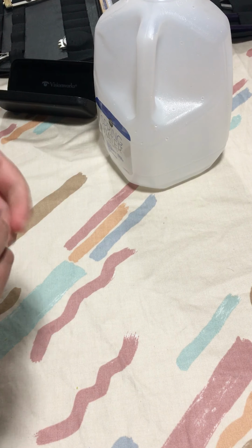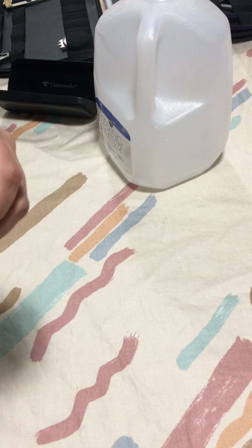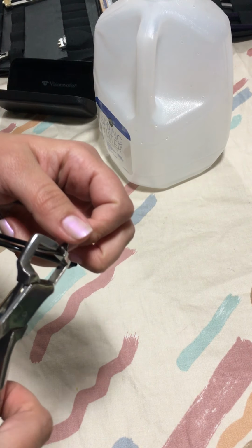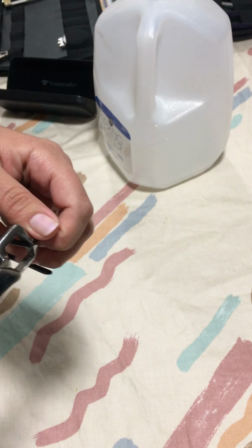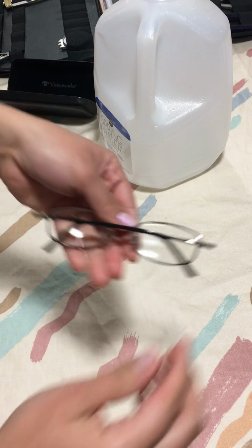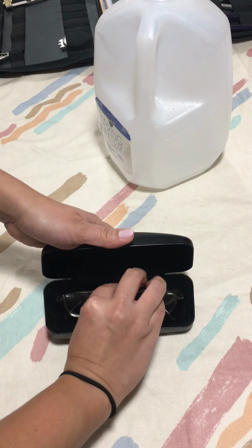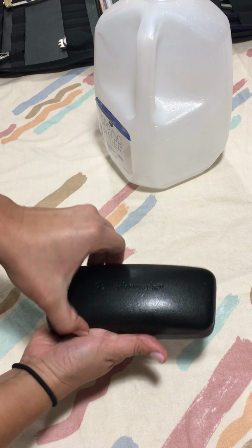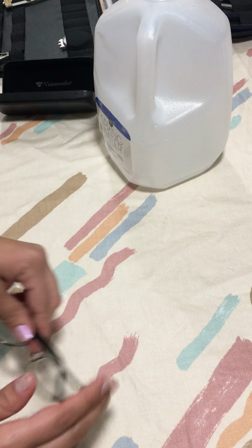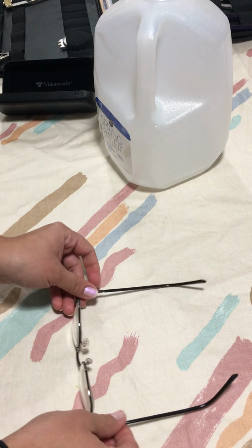Before I finish, I do need to double check if I made any misalignments by mistake, because it's always possible. I'll do a little bit more. Okay, now it's beautiful. See? Now it's beautiful. Now it fits on the case perfectly. There is no problem. The patient likes it. They're not complaining. Now, the last thing that I need to do, though, is to check that I didn't change anything else to it.